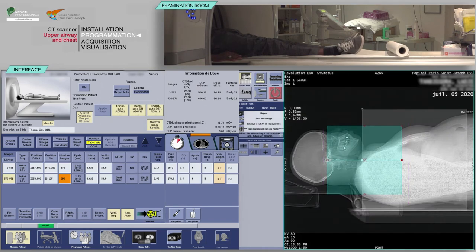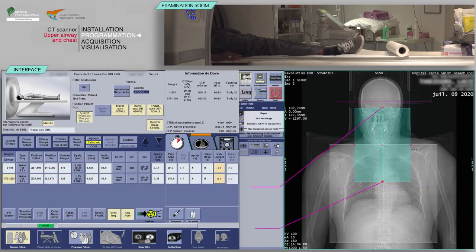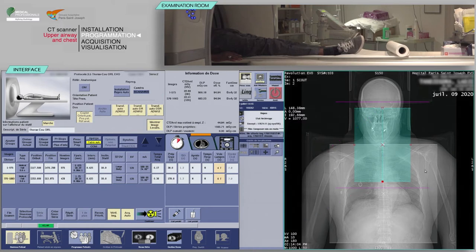Adjust slice boxes as needed. Now, position the second acquisition on the upper airway region from the sphenoid sinus to the mediastinum. Remember to tighten or reduce the reconstruction area, otherwise known as the display field of view, to slightly larger than the size of the neck. This will improve image quality.